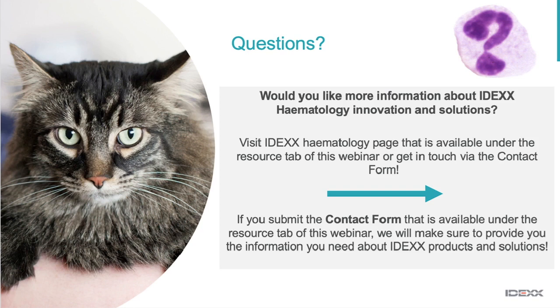I remember what I said earlier in the presentation, that even if we're presenting the analyzers, and I'm talking about even the analyzers at the reference labs, if you present these analyzers with a really abnormal sample, maybe it's an FeLV myeloproliferative type disease, or it does have a severe inflammatory process with a prominent left shift, those are even challenging for the analyzers. And that's why we use things like the cytograms to make sure that we're getting good results. Now, I'm afraid hematology is not easy.